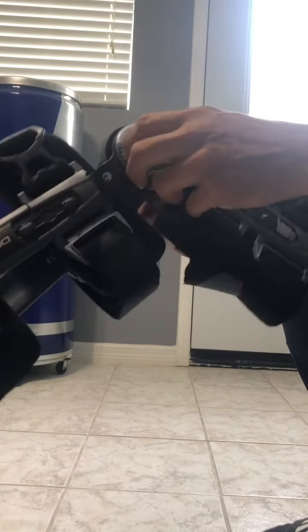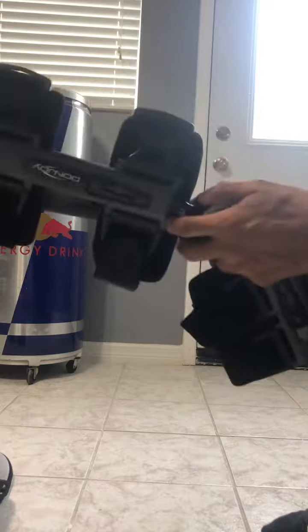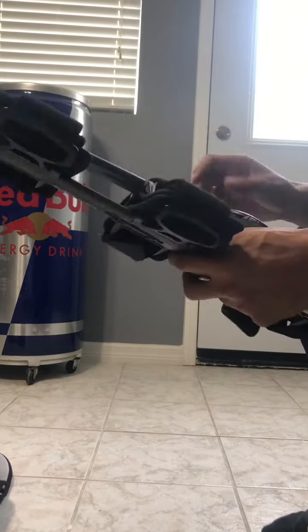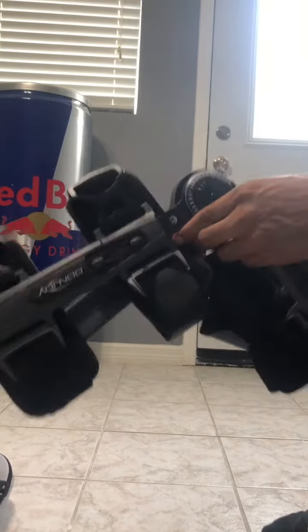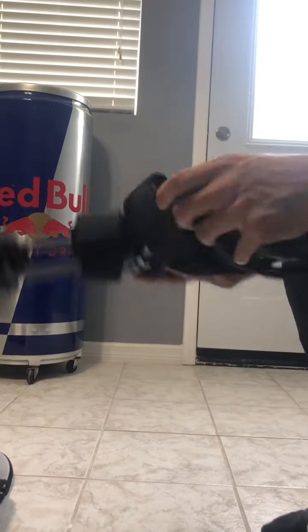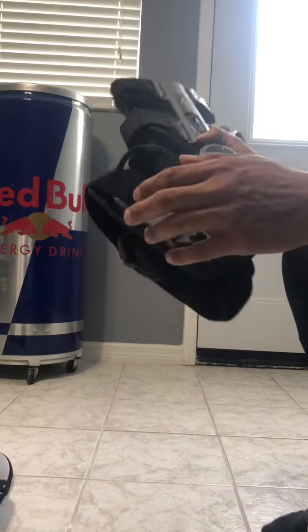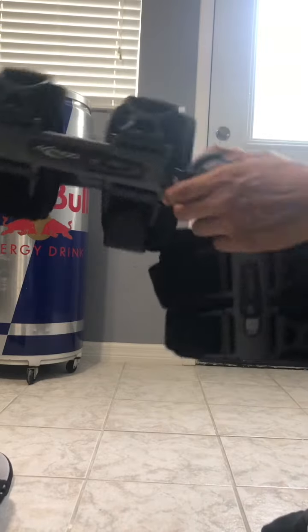This upgraded one has the same basic function but also lets you adjust your flexibility with these knobs over here. The standard one is basically what your provider will give you — it's what they have at the orthopedic office — but you can just go to Amazon and buy the same knee brace at a fraction of the price. This will actually save you a whole lot of money if you don't have insurance or if your coverage doesn't include one.